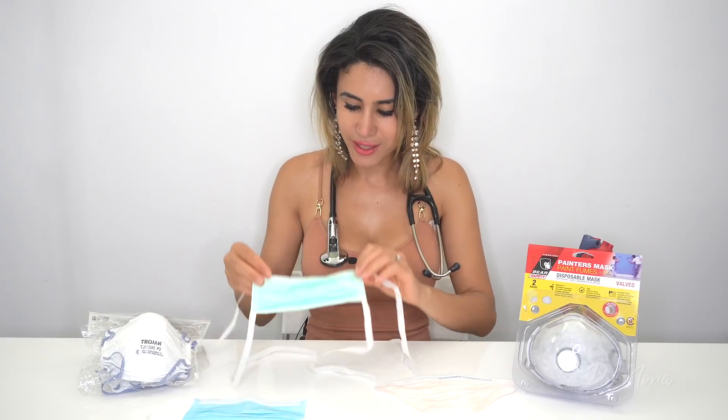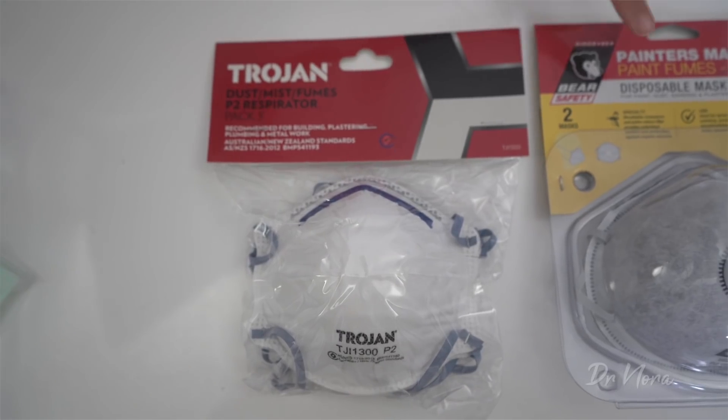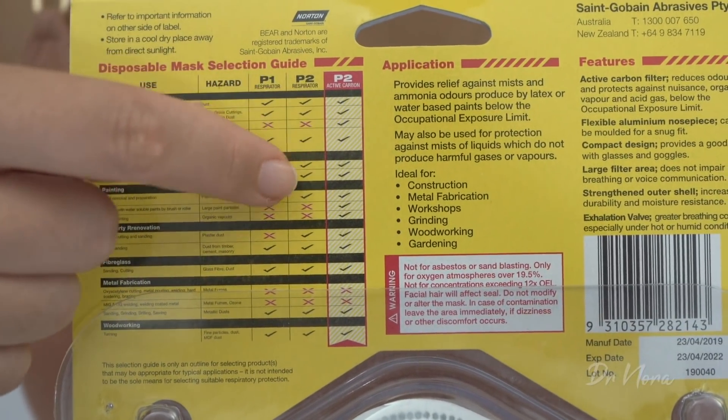So that's the N95 mask. Now let's move on to the P2 mask, which is essentially a mask tested by European standards that gives you exactly the same coverage as an N95 mask — i.e., it blocks at least 95% of small particles. It's really important to read the back of these P2 masks because they can cover for different things. For example, these two different masks do exactly the same thing: they are P2 respirator masks that not only cover 95% of small airborne particles but also cover pesticides, fumes, and odours. Just like the N95 mask, it's really important to have a tight snug fit around your face and to perform a fit check.